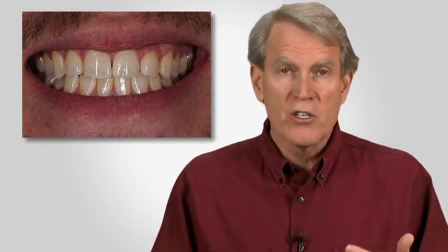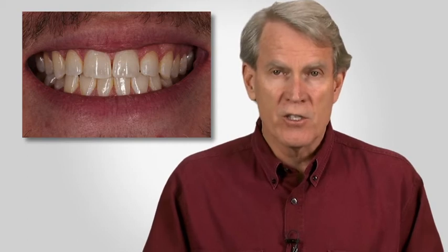teeth. It allows us to see the drape over the teeth, the lips, and their relationship to the gum line and to the edges of the teeth. It allows us to note things like broken fillings or cracked teeth or wear patterns on teeth. It allows us, in this case, to see spaces between teeth and begin to have conversations about that.